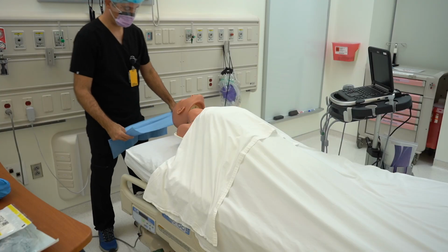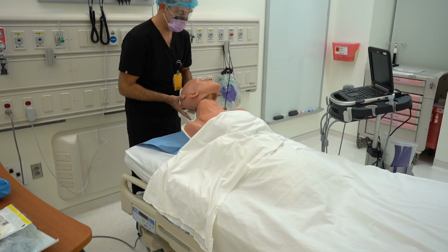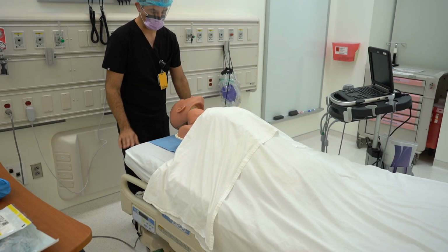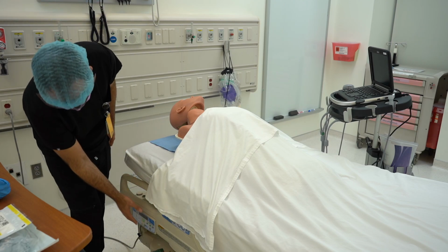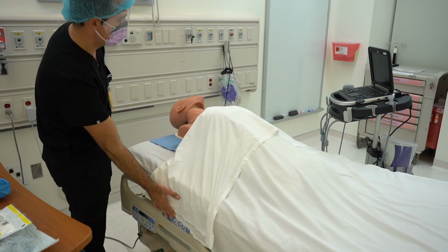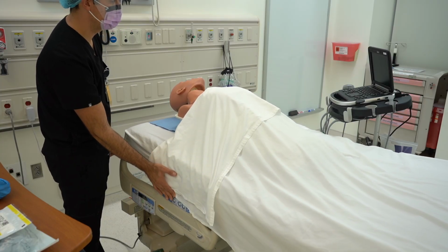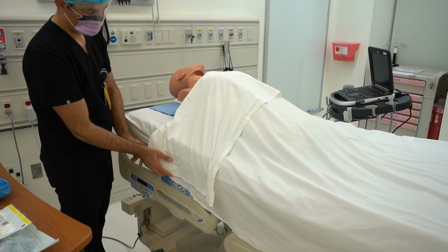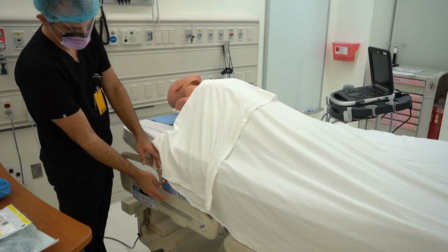Thinking ahead a little bit, we're going to place a chux underneath the patient just to make for easier cleanup at the end of the procedure. At this point, our patient is positioned well, but we would like to do some Trendelenburg. This will help optimize our imaging. Certainly going to want to have the head of the bed at the appropriate elevation for the operator. The Trendelenburg will also assist with reducing the risk of air embolism.